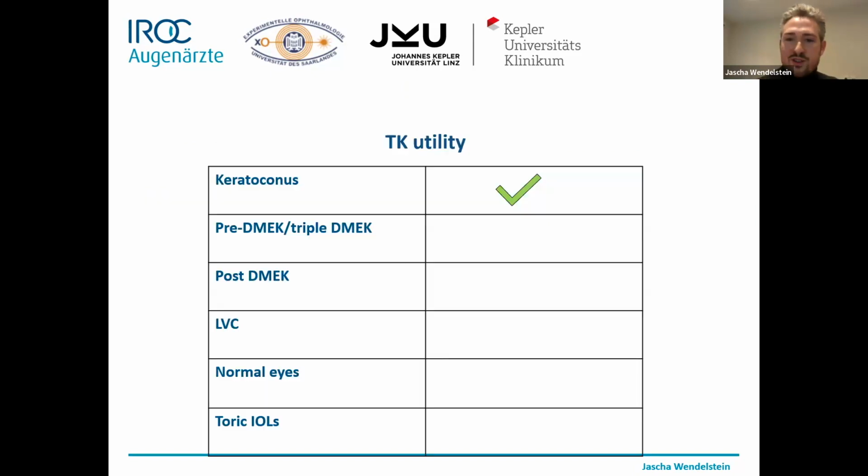So first case is closed, keratoconus eyes. TK values showed some utility in those eyes, and we should stick to using TK values when trying to calculate keratoconus eyes. Let's jump over to the next example.